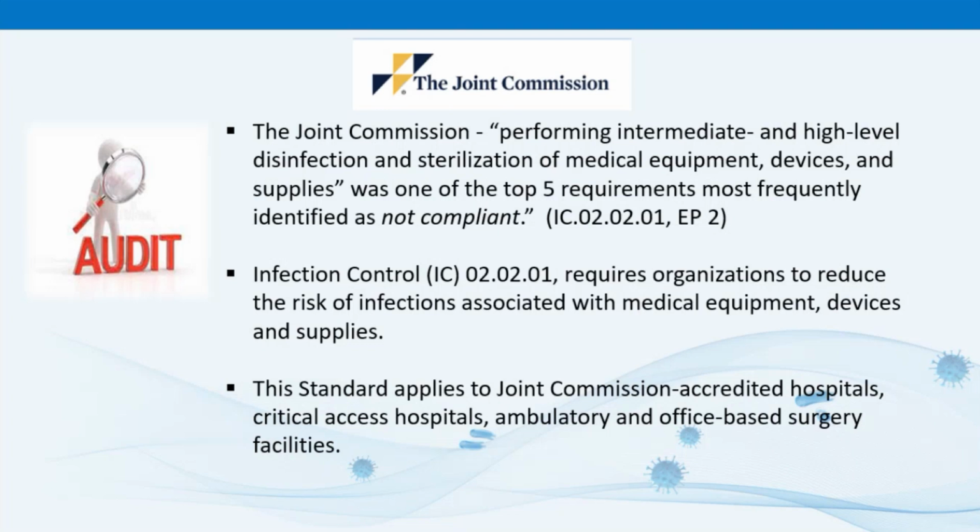Now, findings identified by the Joint Commission Office of Quality and Patient Safety from non-complying organizations include challenges with healthcare professionals who think HLD isn't important or they don't understand the distinction between low, intermediate, and high-level disinfection. They believe the risk of passing bloodborne pathogens or bacterial agents to patients is low or non-existent. They lack the knowledge or training required to properly HLD equipment, and they don't follow processes for HLD. They do things like take shortcuts, they don't follow the timeframes, and they're not using HLD on semi-critical ultrasound probes.